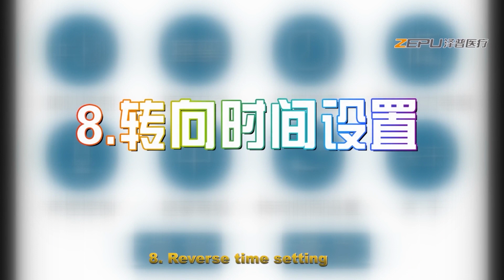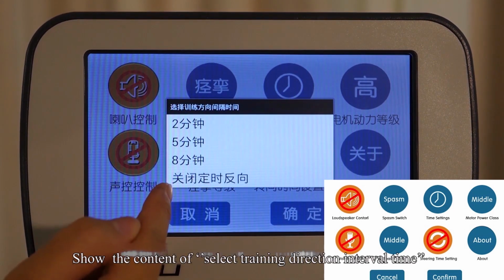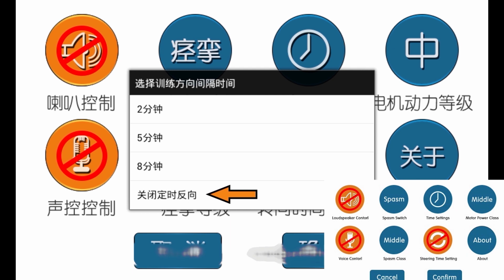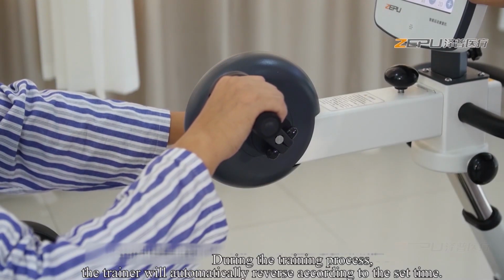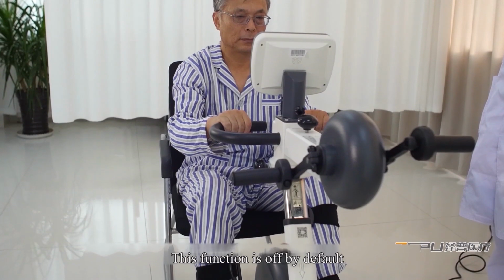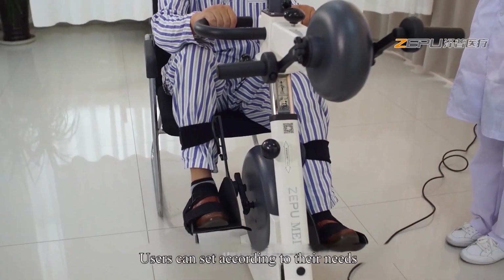8. Reverse time setting. Click reverse time setting. Show the content of select training direction interval time. Choose according to needs: 2 minutes, 5 minutes, 8 minutes. Turn off timing reverse. During the training process, the trainer will automatically reverse according to the set time. This function is off by default. Users can set according to their needs.